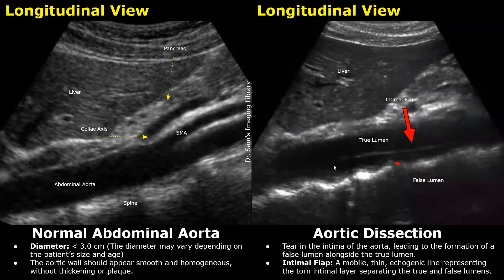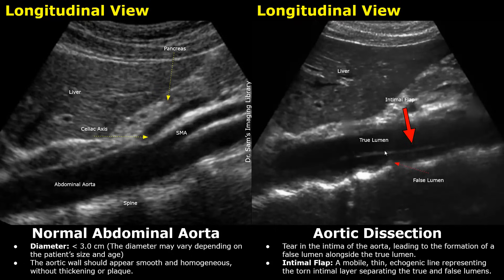Aortic dissection is the tearing of the intimal layer of the aorta — the innermost layer — which forms a false lumen within the vessel. Only the inner layer is torn and it starts floating into the lumen. This mobile, thin, echogenic line is called the intimal flap. The area under the flap is the false lumen, and the larger area above the flap is the true lumen, the actual lumen of the aorta. Usually the false lumen is smaller than the true lumen.